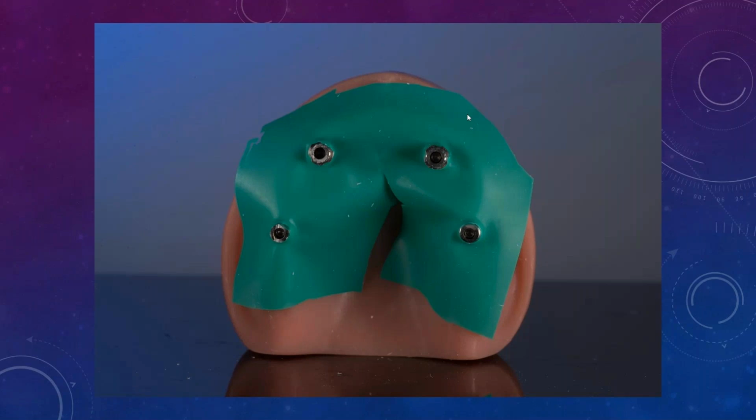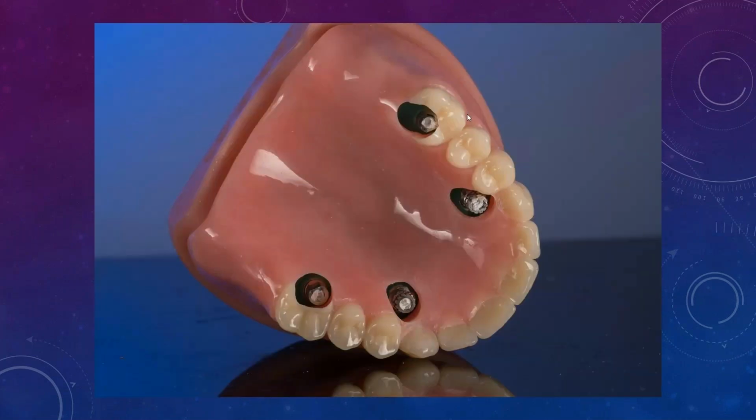That means your surgeon probably didn't do enough bone reduction, and that's going to cause you some issues down the line. So cutting a little bit is okay, but if there's barely any of that Ti base left, then you understand that you probably don't have enough bone reduction. So once I have everything cut, I'll protect the area with some rubber dam. And as you can see, you want to make sure those holes are big enough to where it's not touching the acrylic anywhere. In this case, it's touching it here. You might want to adjust it a little bit more here.